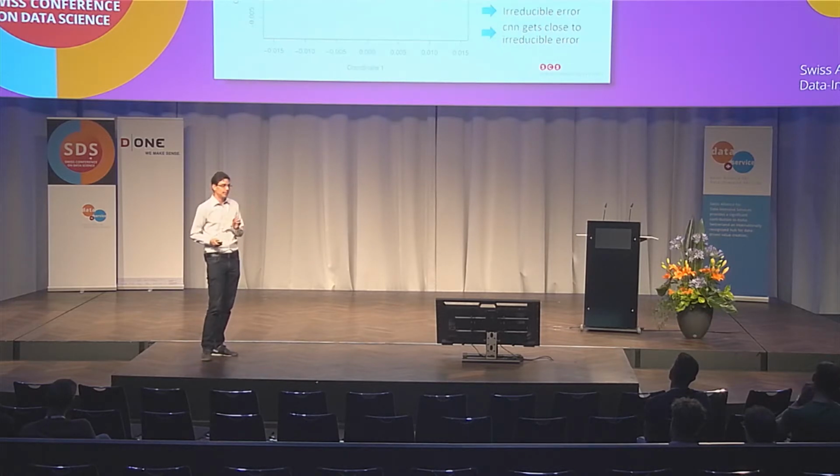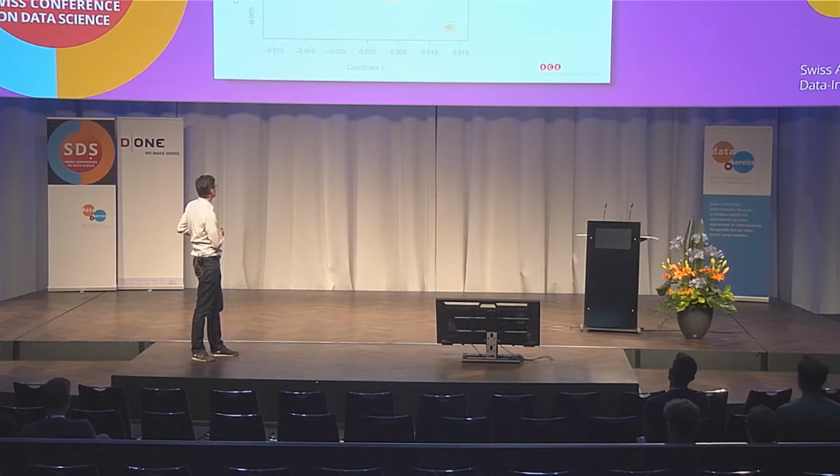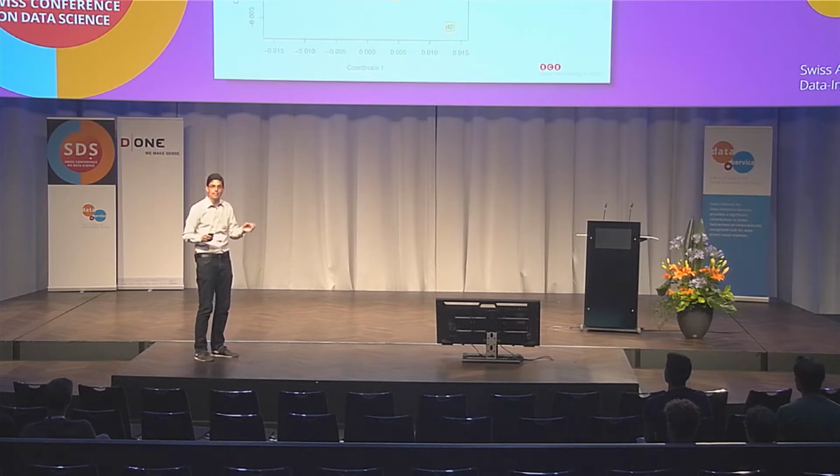Now we wanted to investigate further the variability of possible ground truth labels. So we asked another 3 ophthalmologists to label the test set, and you can see the results here. These are 3 additional doctors. They are different from the expert who generated our ground truth. These are different people, and we didn't use the data which they labeled as training data. We only asked them to label the test set to see the variability among possible ground truth labels.